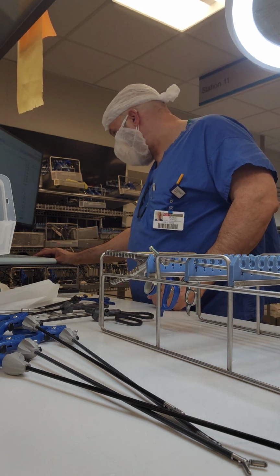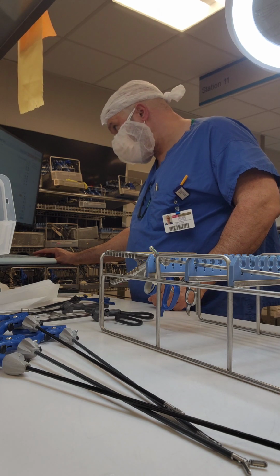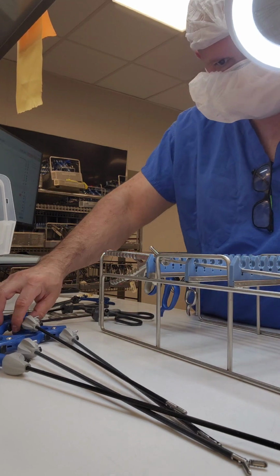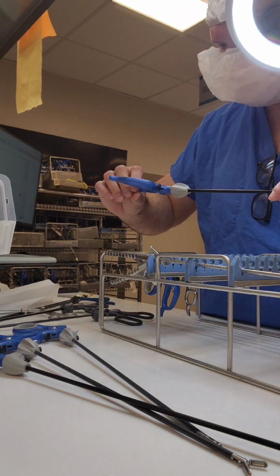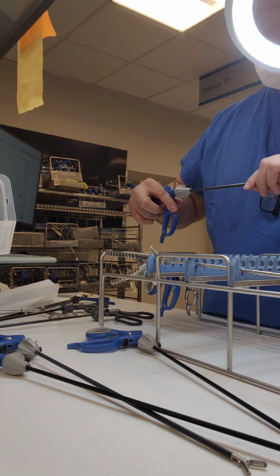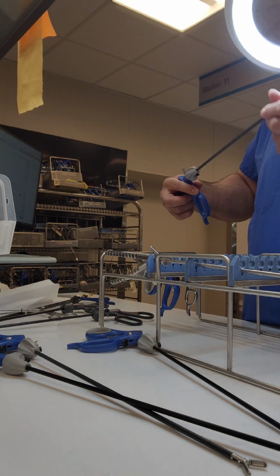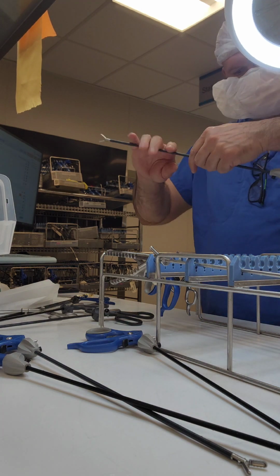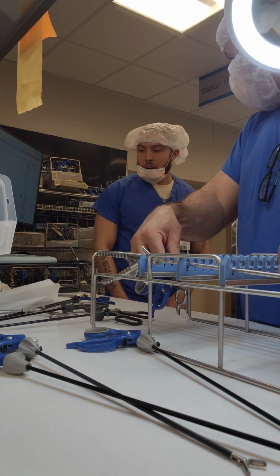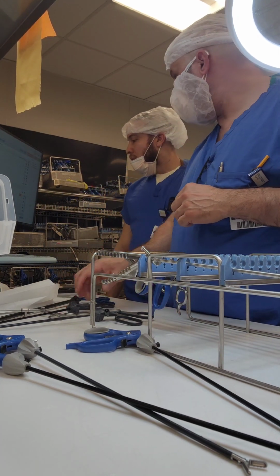All right. And I did a little skimpy job there with the inspection. You see how quickly I inspected that. That was cheesy. That was garbage. Okay. And looking for a part number here for an instrument that I know. All right, looking at that jaw there under magnification, which I should have been doing with every single instrument.